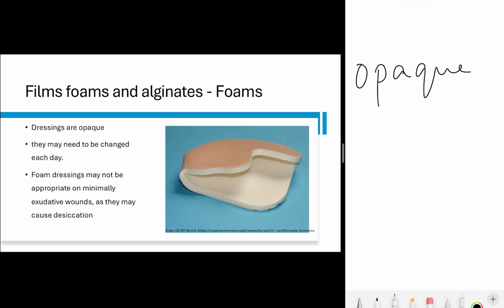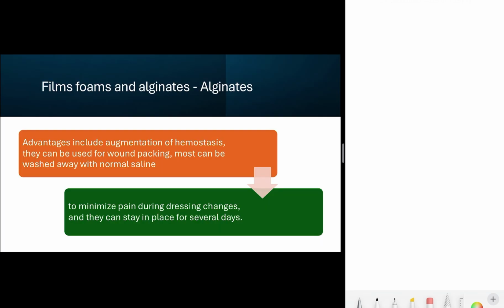So what is desiccation? Wound desiccation is the drying out of the wound, which impedes healing by killing cells and forming a scab. So for this reason, foam dressings may not be appropriate on minimally exudative wounds.